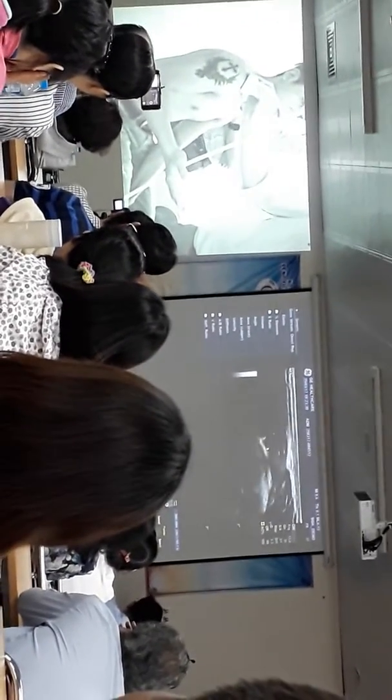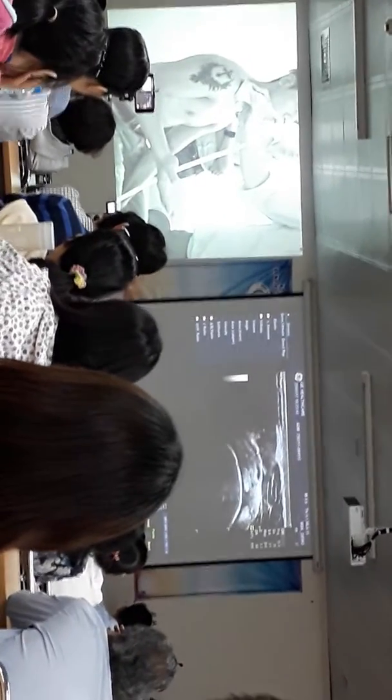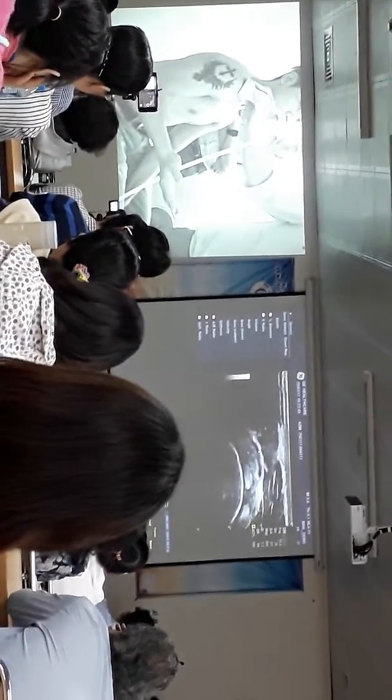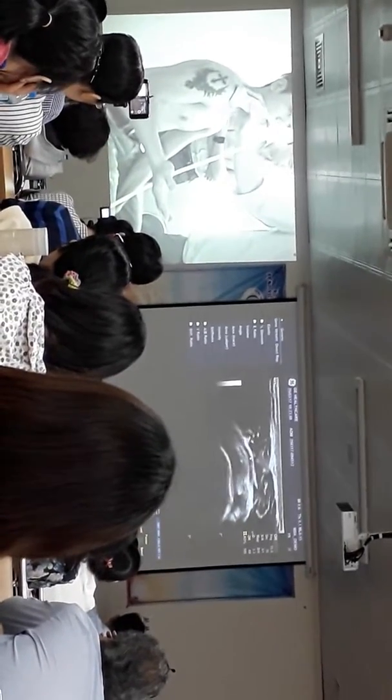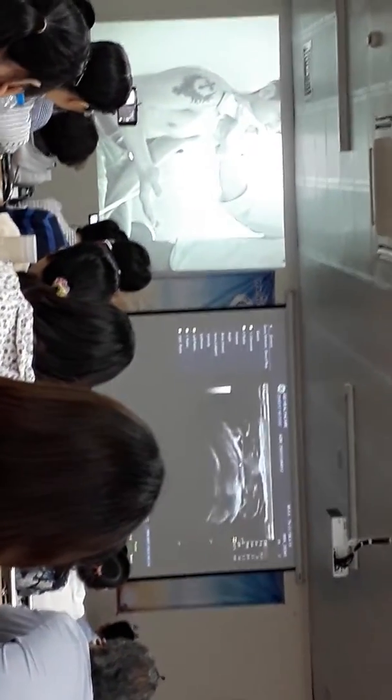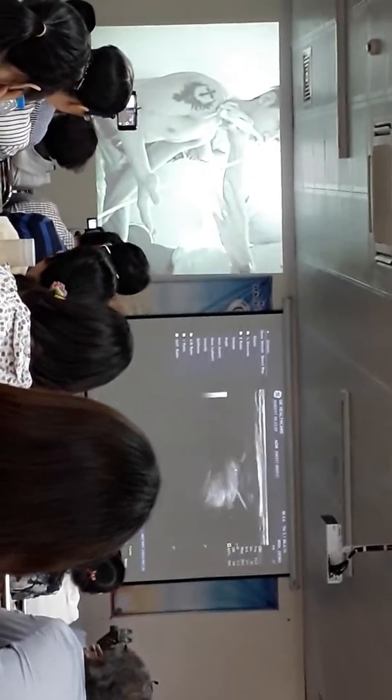Unfortunately, ultrasound is very good at finding things that don't really matter. So we have to constantly go back to, is this relevant to the patient's condition? Cái siêu âm thì rất quan trọng với những cái trường hợp với những triệu chứng của bệnh nhân xem là không quan trọng nhưng mà sao không phát hiện ra được.